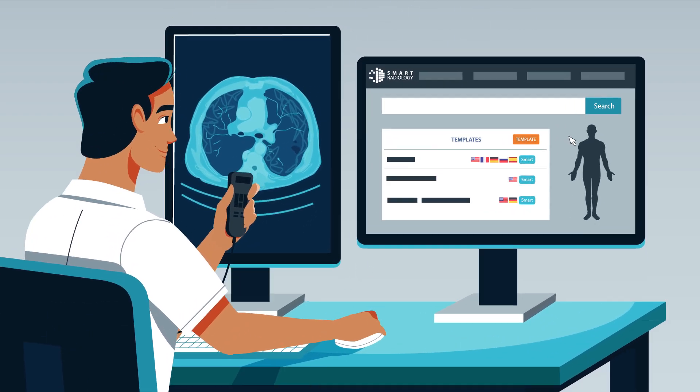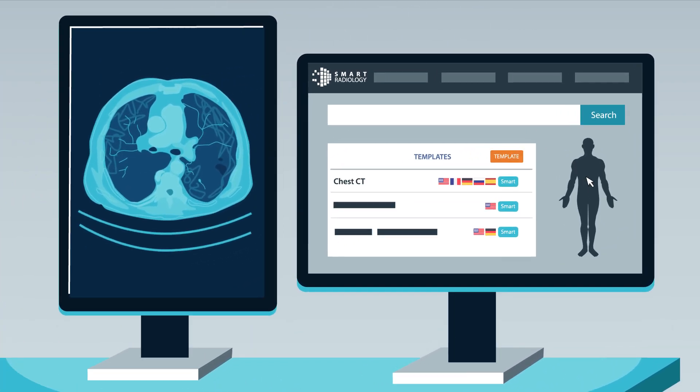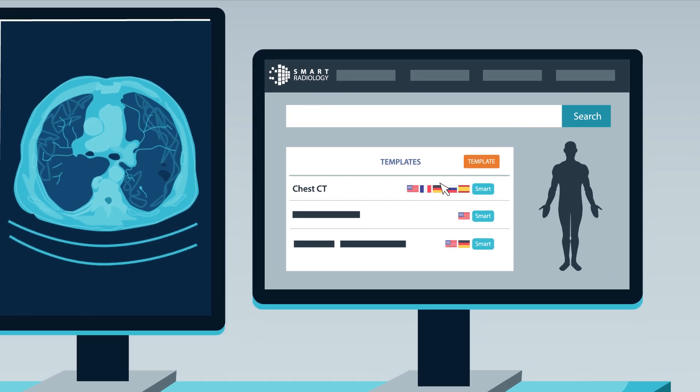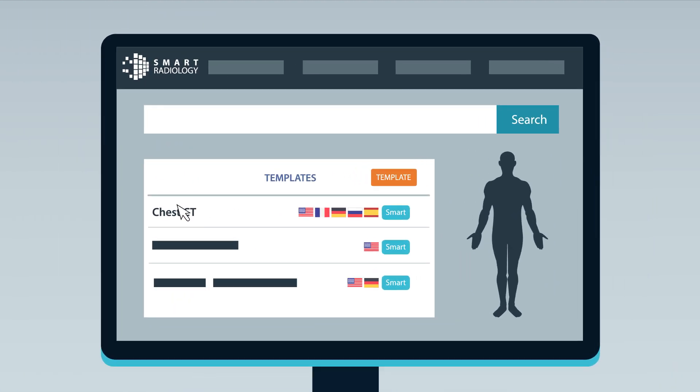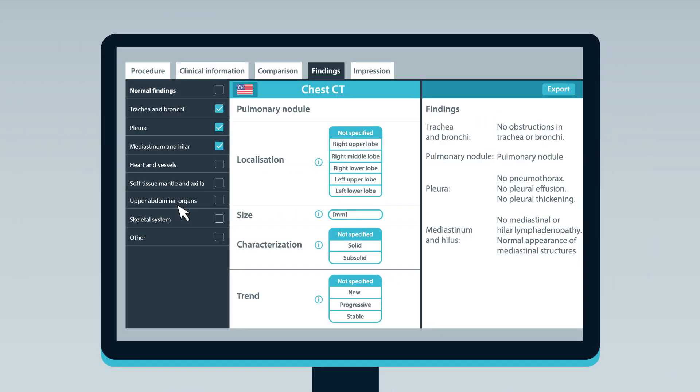Smart Radiology uses optimized reporting templates to create structure automatically. The relevant criteria for the report templates are selected by you, the user.